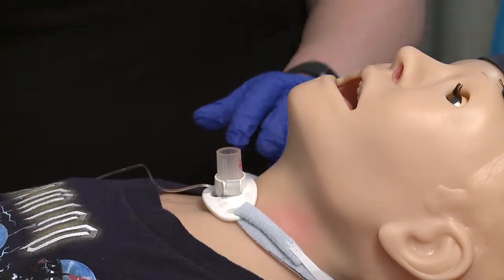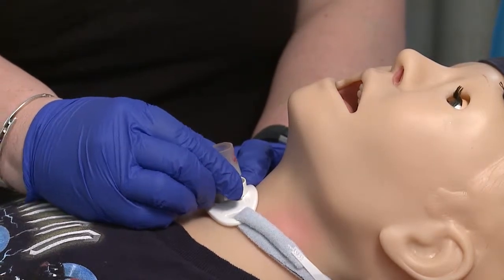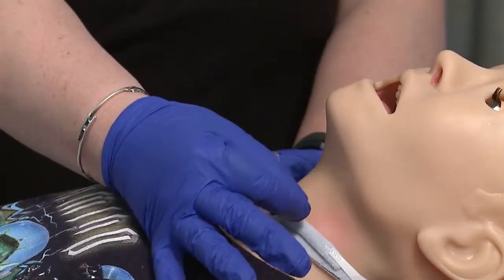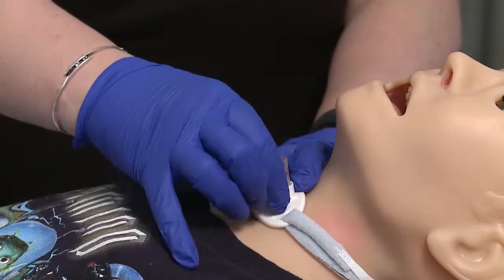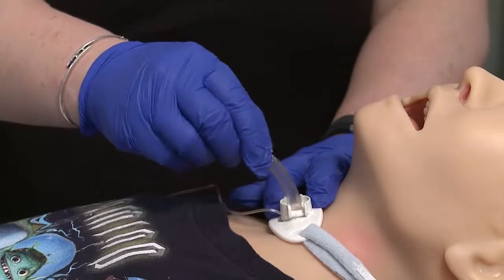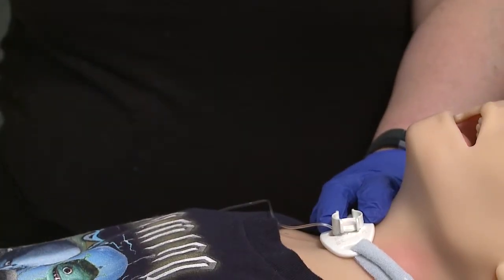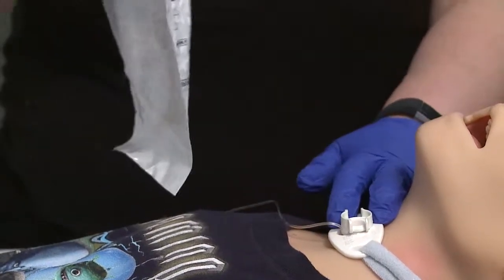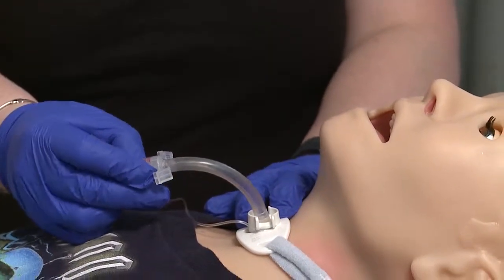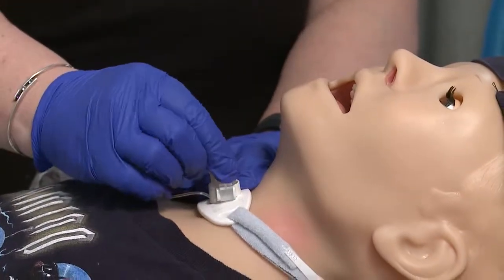If you have a patient with a larger trach that possibly has a disposable inner cannula, when you are doing trach care you would do it the same — clean underneath, clean above. You would stabilize your trach, then take the inner cannula out by pushing on the wings. You would either clean this inner cannula to put it back in, or if you have a new inner cannula available, you would take that out of its packaging and it goes back into the tracheostomy, pinching those wings and seating it into the flange.